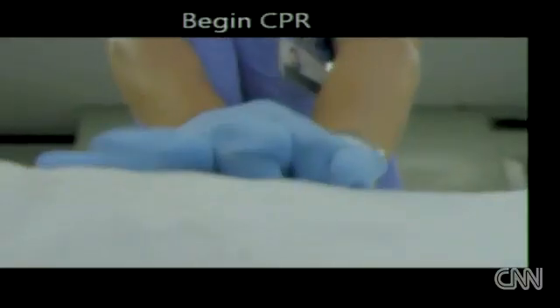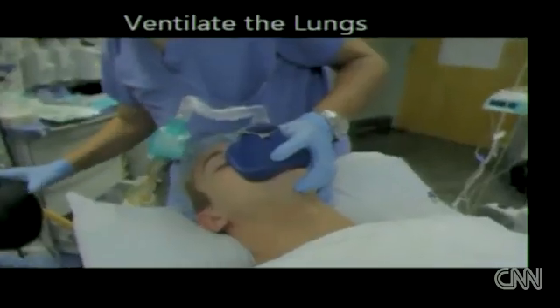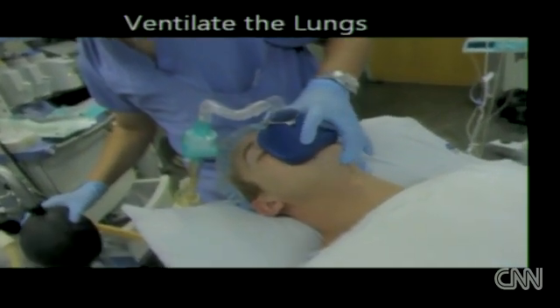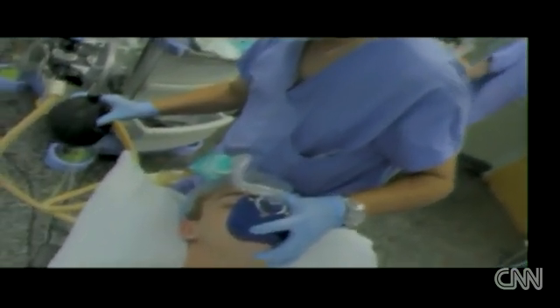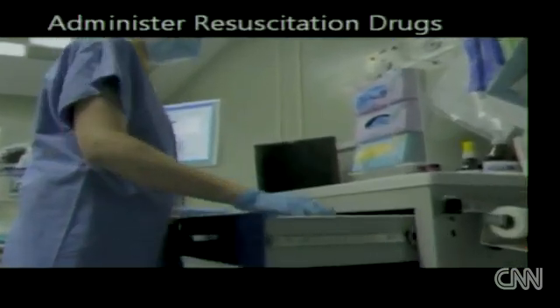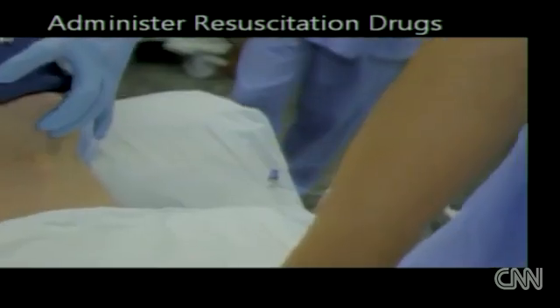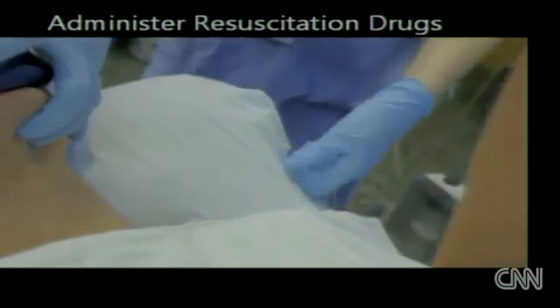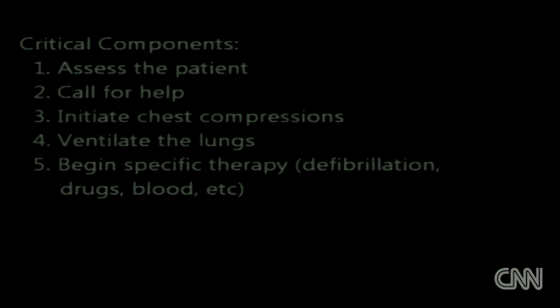One person begins CPR. The chest compression is shown here. Dr. Ahung is now ventilating the lungs, shown here. Emergency drugs are drawn up for resuscitation. This right here is lidocaine, which might be given for resuscitation. Other drugs that might be given include drugs like adrenaline.